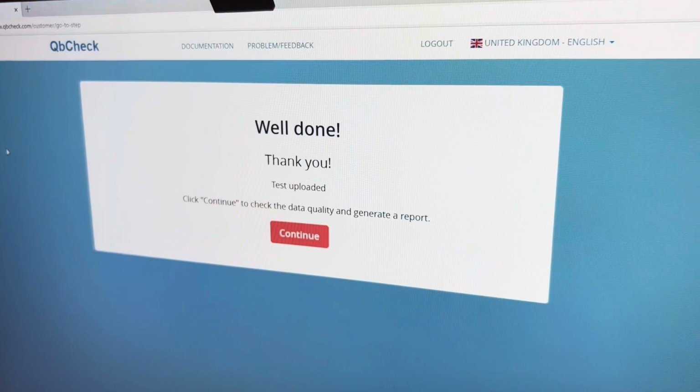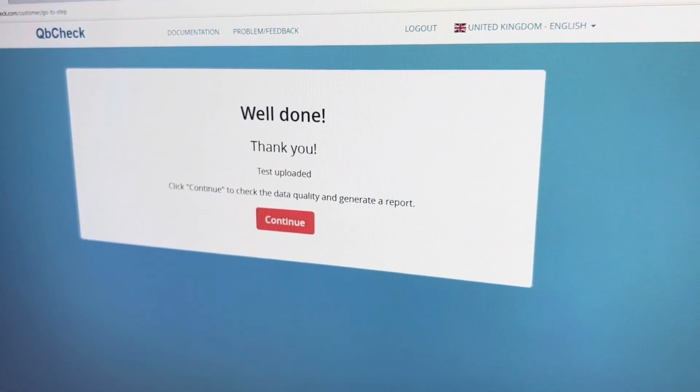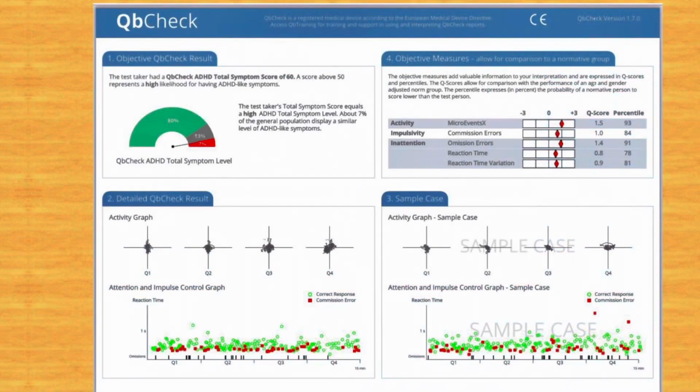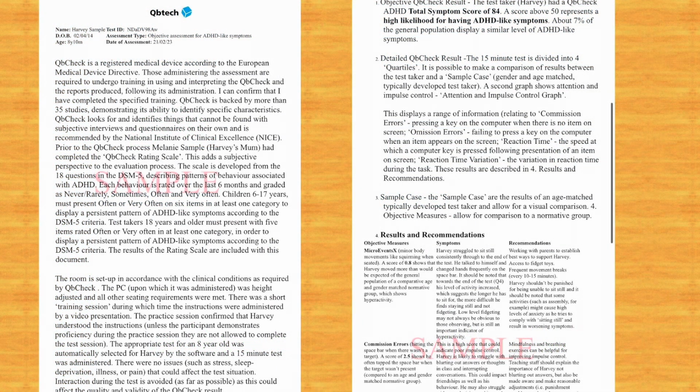The camera can record this foot tapping as it travels up through the body, even though it might not be seen under a desk. You'll be relieved when you see that the test is finished and you can go and sit down while I check the results. Results take about a week and they include a comprehensive report including appropriate recommendations.